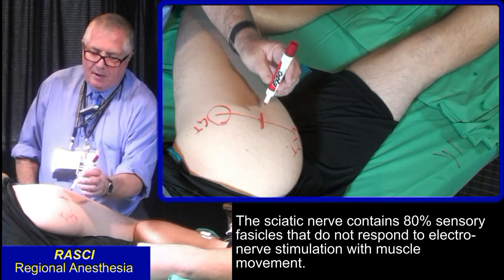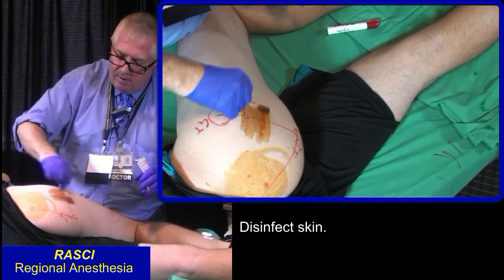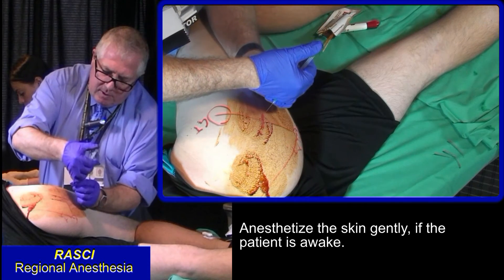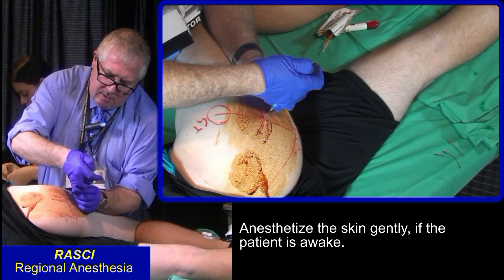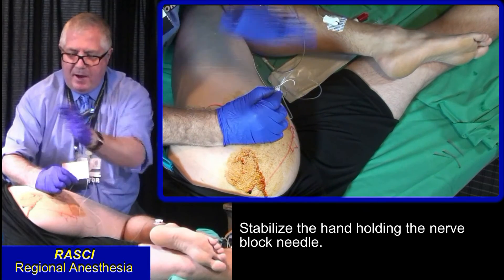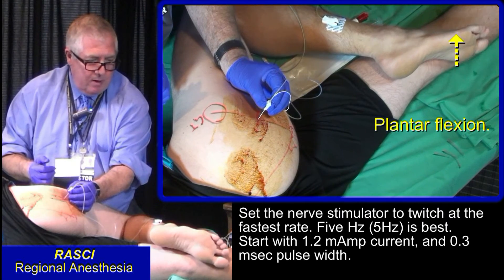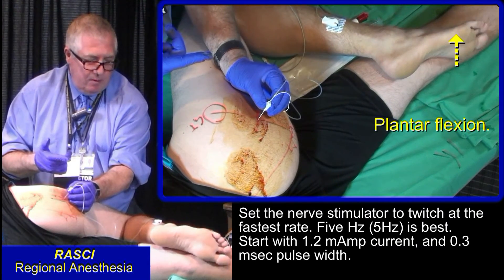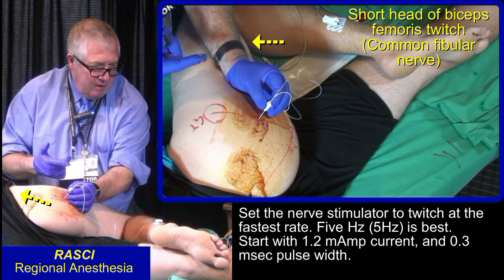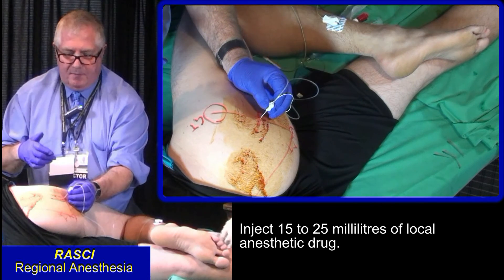If you are going to use a nerve stimulator technique, you can insert your needle straight there. There comes a little mosquito bite. I'm going to introduce my needle through flesh. Notice how my hand is braced so I can keep advancing. I've gone straight into calf muscles. Now it's just a question of adjusting. There's a bit of a flicker there at 0.4 mA. At this point, I'd inject 20 milliliters of drug.